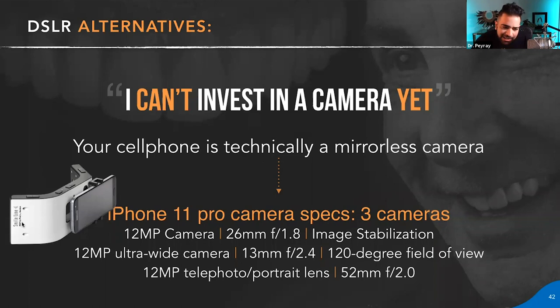I do know there are softwares and apps that connect to your phone to where you can take a picture of the patient and it goes right into their Open Dental or Dentrix or one of those. I haven't done this myself because the way we do it, we try to do DSLR pictures with our DSLR. So I don't use the iPhone for this. I use the iPhone for videos mostly. But again, if you want to be super HIPAA compliant and make sure that you take a picture with the iPhone, then make sure you're able to connect it to your dental management software.